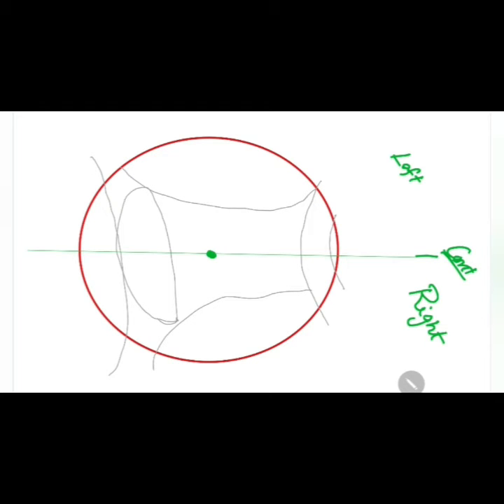Right? So another very important thing that you have to note is, whenever you place an electrode on the right side, you should name it with even numbers, whereas here this should be named with odd numbers, right? First, as I told, we are placing this electrode here. This is the center region, right? This electrode should be named as C, and this is lying on the 0th line, so I'm going to rename it as CZ.